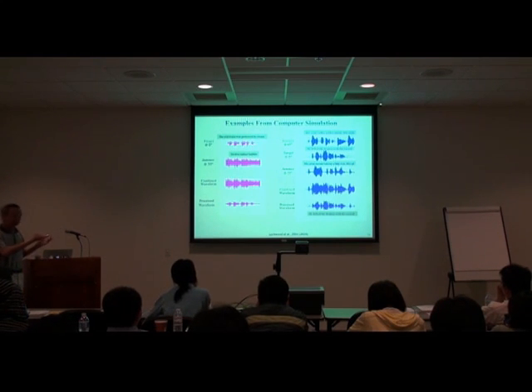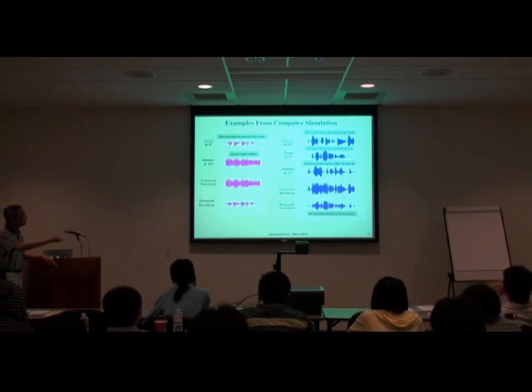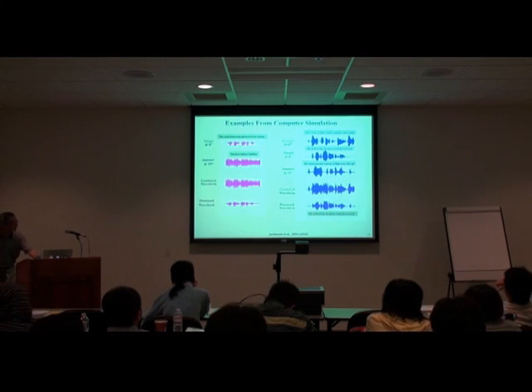Now, when you have 2 jammers or 4 jammers, let's say there's a jammer at 65 degrees, another jammer at 22 degrees. These jammers are again more intense than the target signal at 0 degree. The combined waveform is dictated by these 2. But once we process, we are able to recover a lot of the signal of interest, namely the target signal.